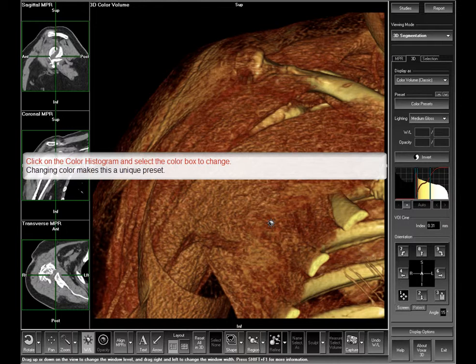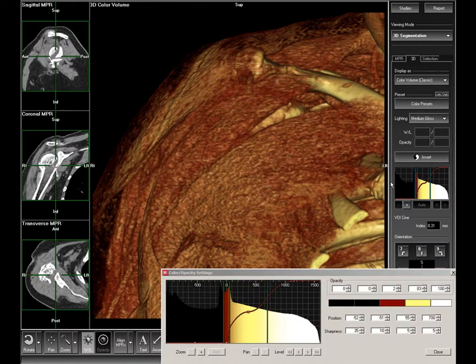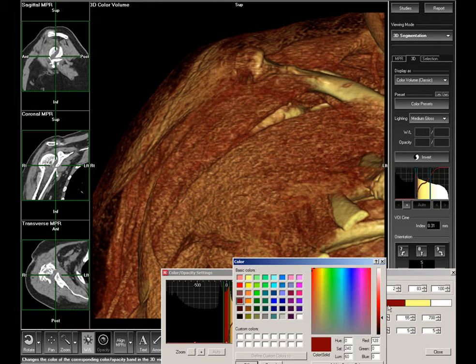Often, changing the color can have a dramatic effect on the images. Click on the histogram. Select the color dialog box that corresponds to the range of densities that you want to change, then select from the options.